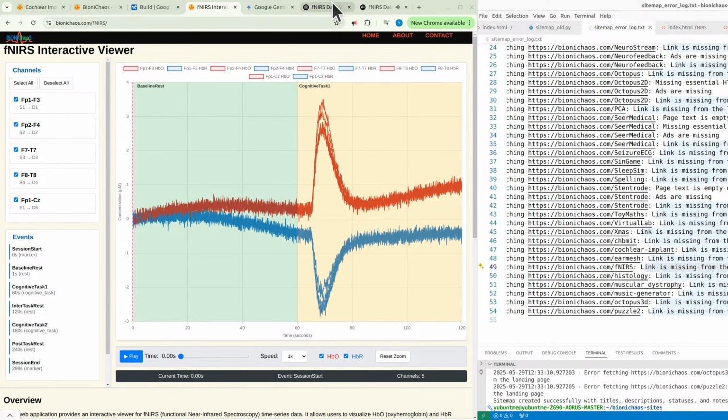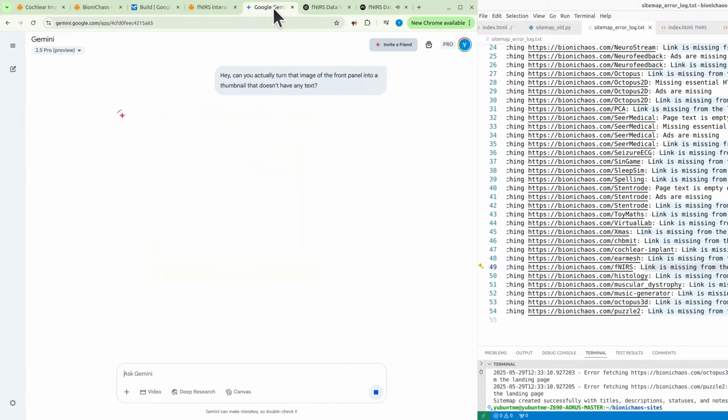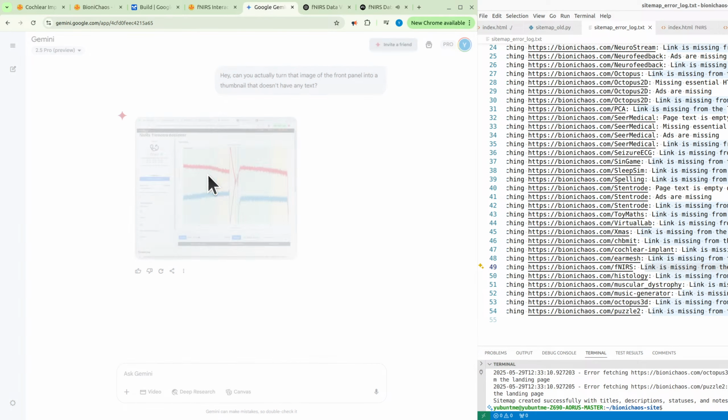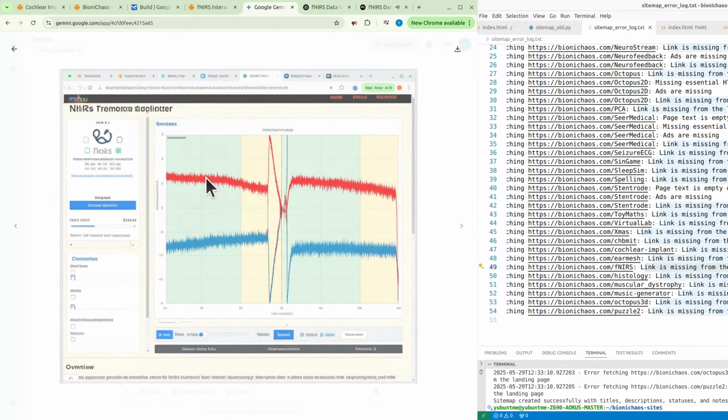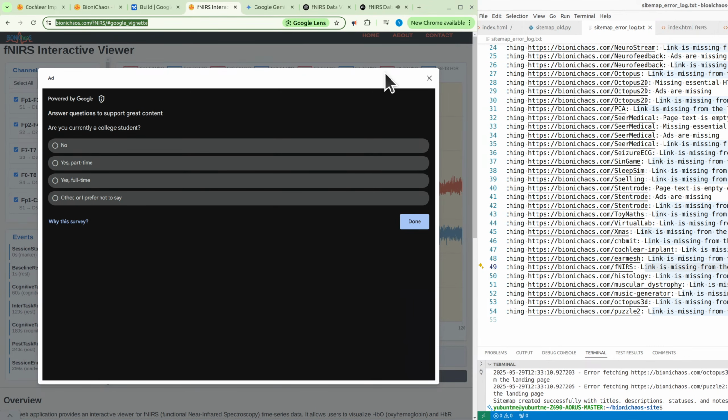The labels, like Fp1, F3, or F7, they come from the 10-20 system. The 10-20 system, that's standard for placing EEG electrodes, right? Exactly the same system, mostly. It's a standardized way to place sensors based on skull landmarks, so Fp1, F3 roughly corresponds to the same prefrontal area across different people. And the source says the channels shown here cover frontal and temporal lobes, areas for, like, executive function, memory. That's what it indicates, yes.